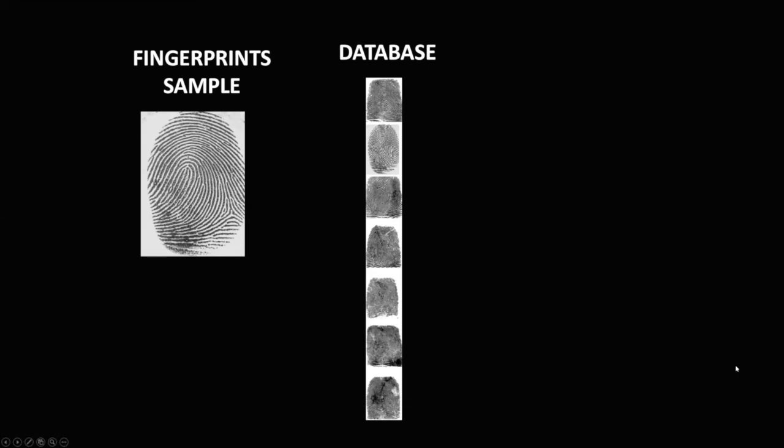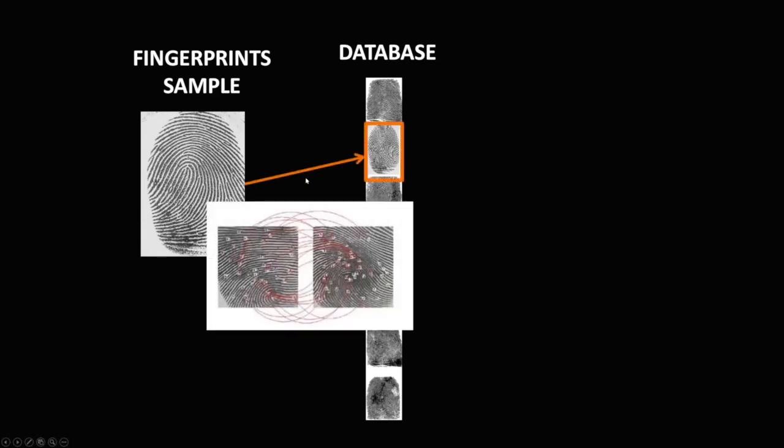The name or the concept of MR fingerprinting is analogous to the conventional fingerprinting technology. Basically, if we have a fingerprint from a person, by using pretty advanced template matching technology, if this sample can be matched to one fingerprint from a comprehensive database, a host of additional information from this person, such as name, phone number, and address, can be extracted simultaneously.